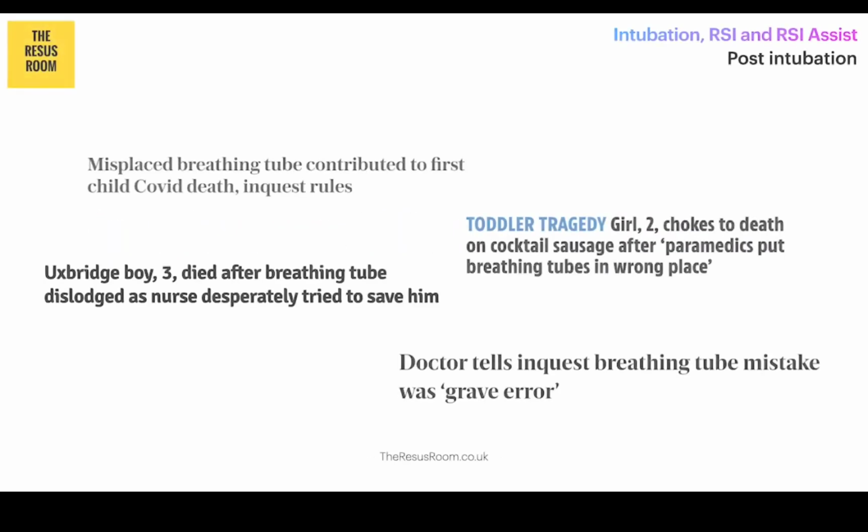Unfortunately, in the very recent past, there have been reports in the media about the failure to recognise esophageal intubation, and these cases are absolutely tragic. But when I read these reports, what I always try and remember is that none of the clinicians in these cases set out to cause harm. And because of that, there is clearly the potential for error here. And that error might have absolutely catastrophic consequences. Now we're all fallible, so we all need to know about this.